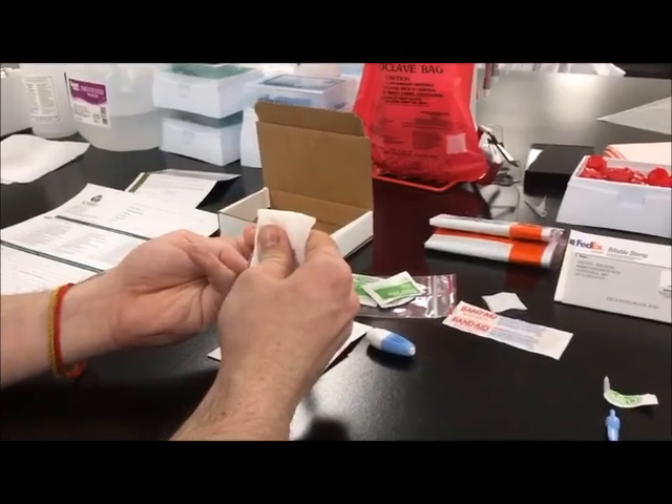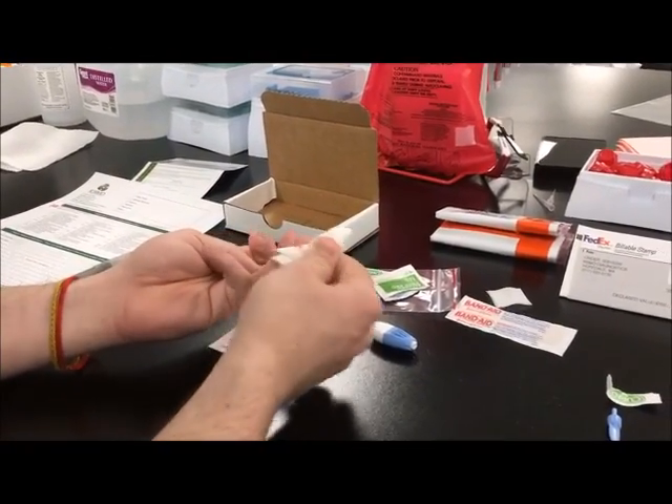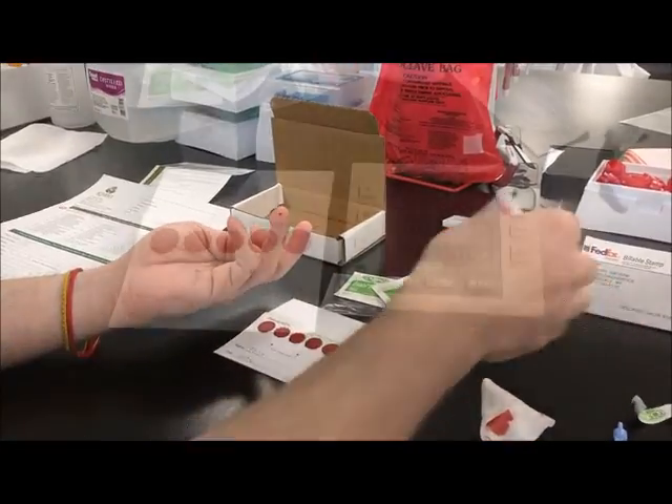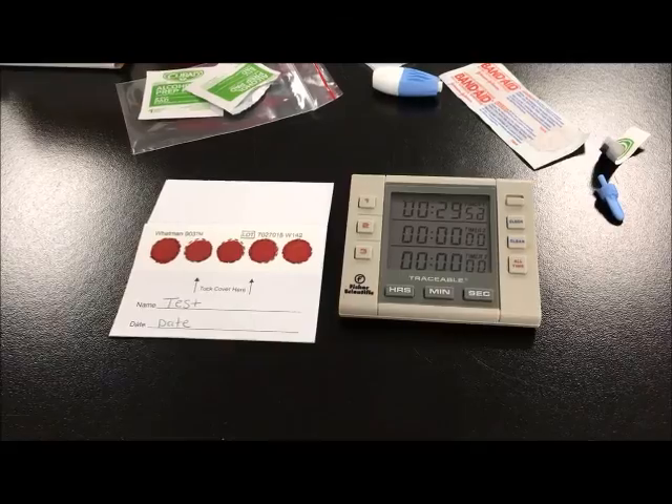Do not allow your finger to touch the card. Apply pressure to the puncture site with gauze and bandage the finger once bleeding has stopped. Allow the card to air dry for 30 minutes.